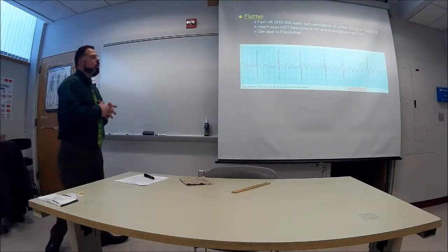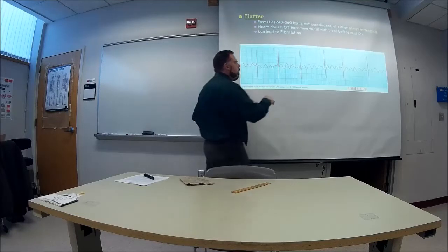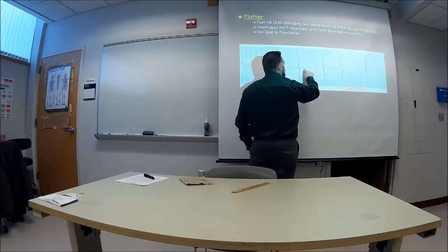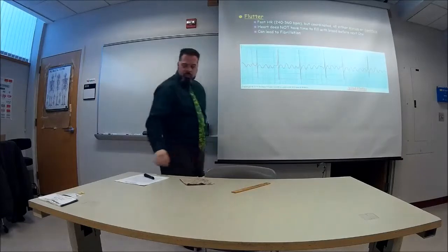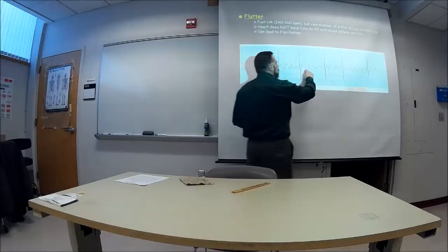Basically, if it's the atrial, and that's what is shown over here, you'll see a couple of P waves or something. There's something going on over here, and then the QRS, there's the T. You can see a nice, distinct few P waves, but we don't call them P waves. We call it a flutter. Like a bird would flutter, right? So flutter, flutter, flutter.